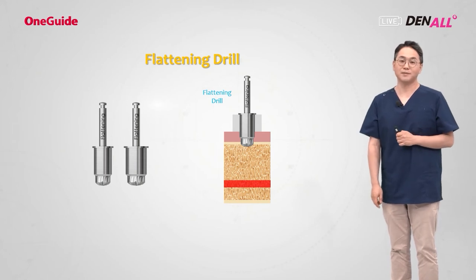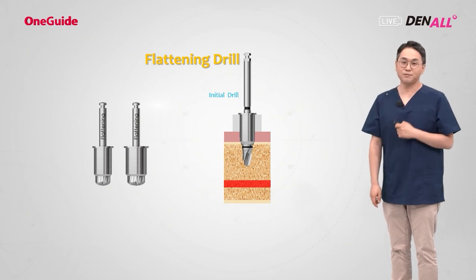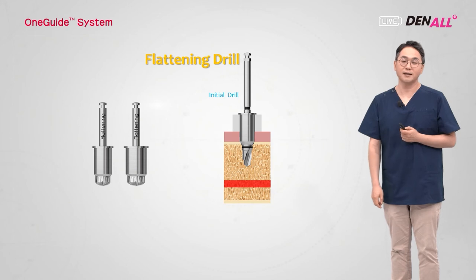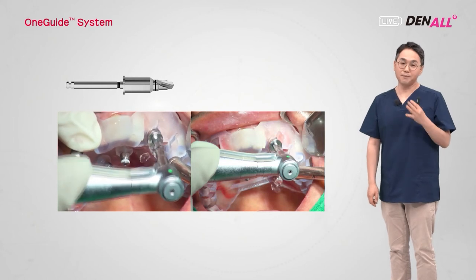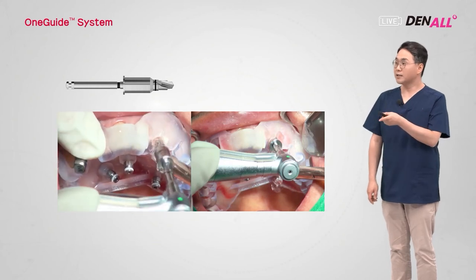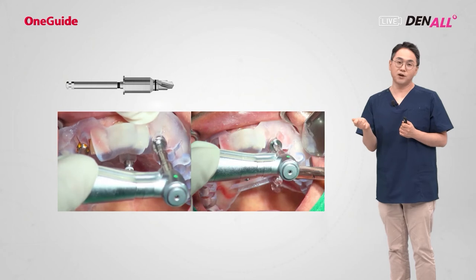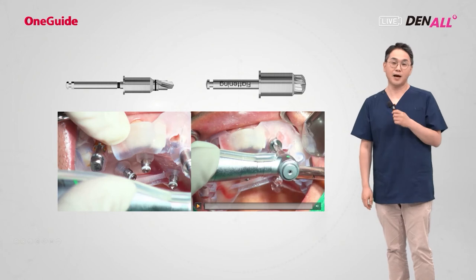Let me show you a case. Initial drill can go into the full depth, meaning the stopper of the initial drill can reach the top of the guide hole. If you look here, maxilla location 23, guide is fixed, initial drilling is done. The stopper cannot reach the top of the hole. If you just apply more pressure, it cannot advance. It will break the guide or displace the guide. So you need to use the flattening drill.